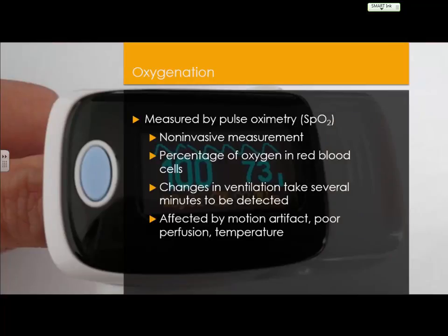There are a couple of parameters of a respiratory assessment that you know, but you really need to understand why. As paramedics, we're still going to use SpO2 as a monitoring tool, but it's more of a monitoring tool and not as much of a diagnostic tool, or not as good of a diagnostic tool as end-tidal CO2 when it comes to ventilation and oxygenation.